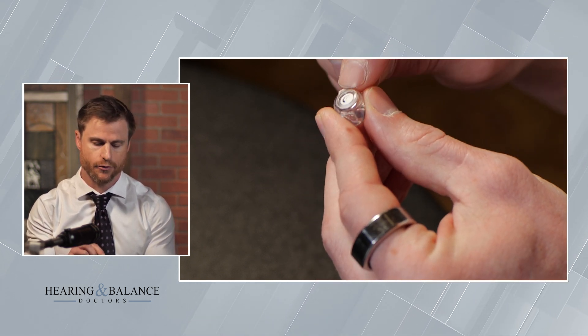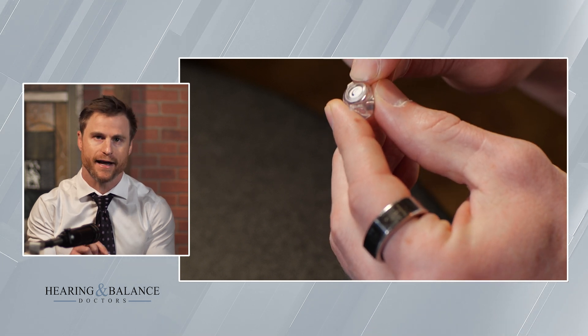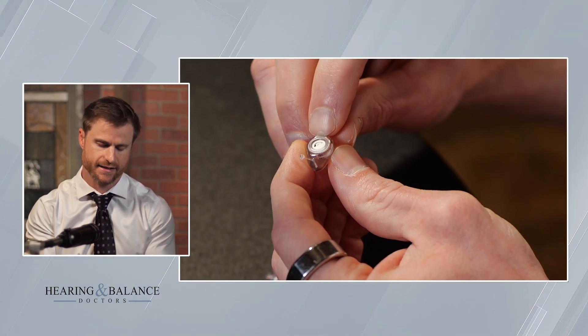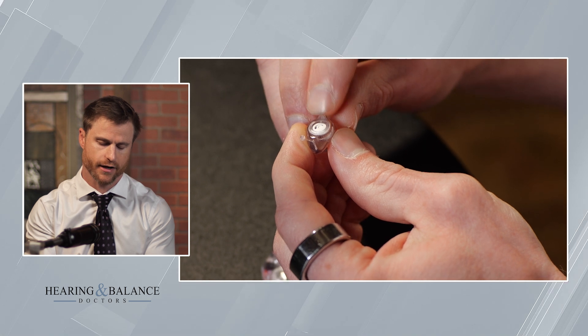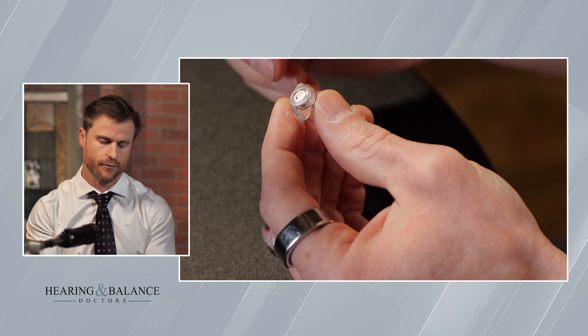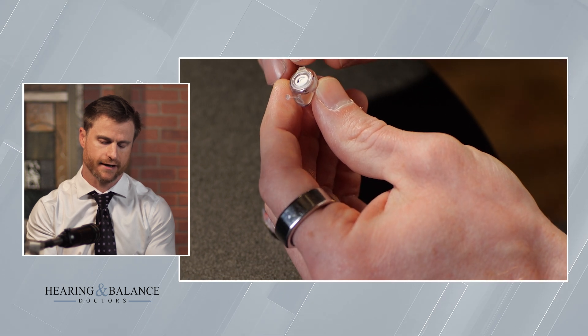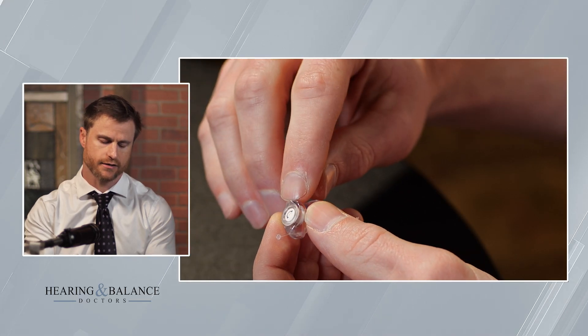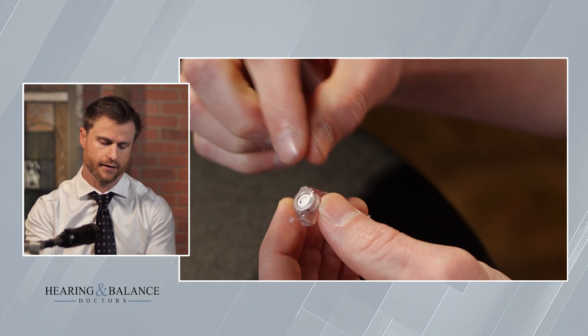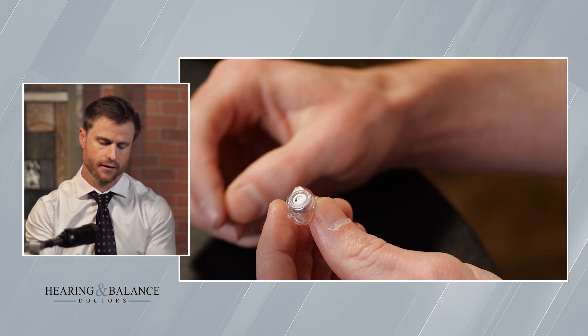There are different levels of attenuation with these filters. They're plug and play, so you can take these filters out and replace them with a different level of attenuation. Right now what I have is a 9 decibel level of attenuation, but they make them all the way up to I believe 25 decibels. So depending on how quiet you want it, you can choose the appropriate filter. And these things are so easy — if you wanted to take them with you, you'd have just like a little plastic baggie. They're color coded too.